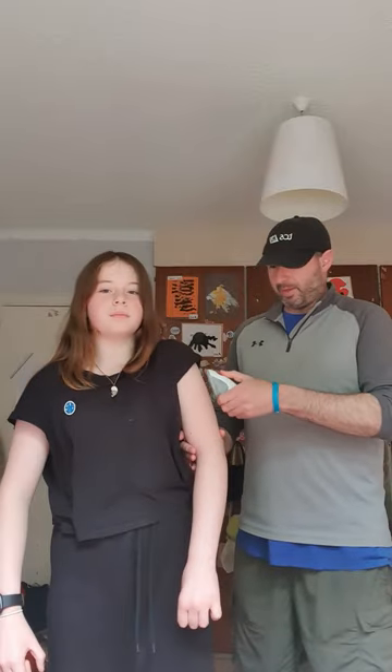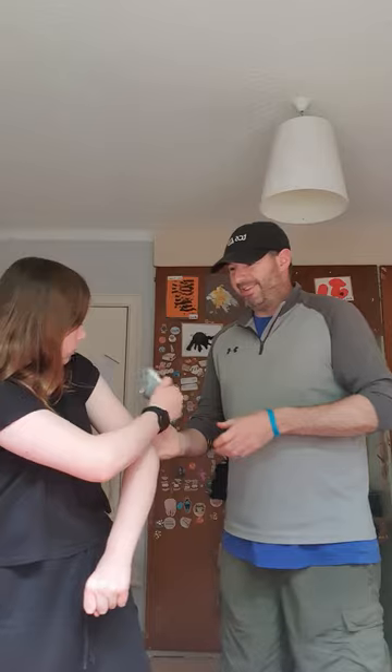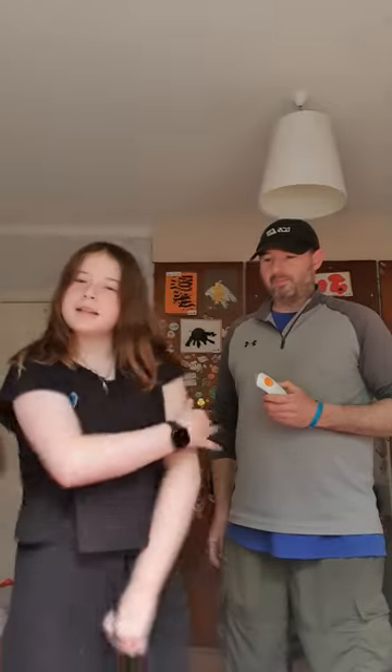Once you've brought your unwilling parent up — or helper, sibling, or friend, even though I wouldn't really recommend a little sibling — you'll get your desired spot, place the sensor just above where you want it, and when you're ready, put it on your skin. Then press down that orange button as far as it'll go. So dad I would like it here. Small mishap — that's okay.